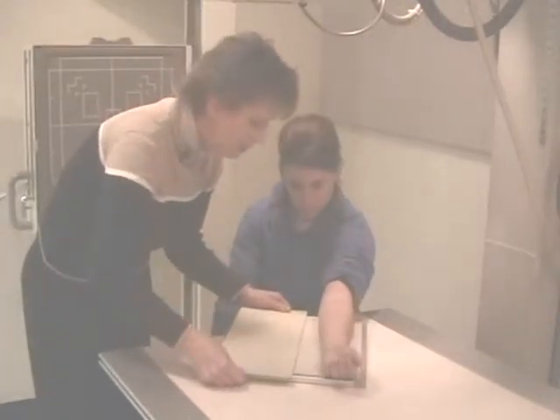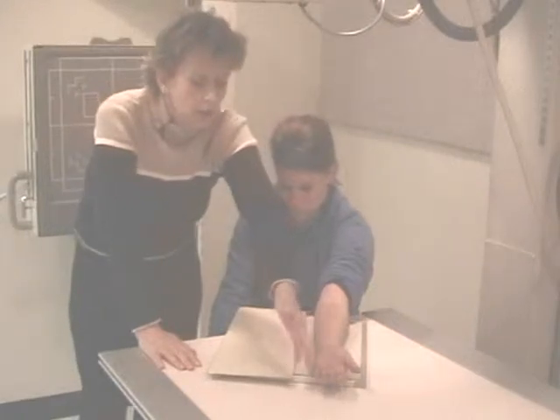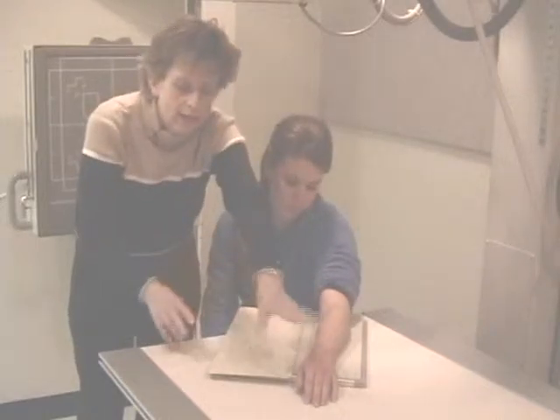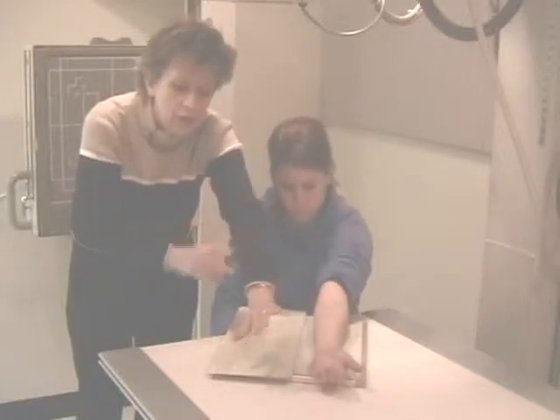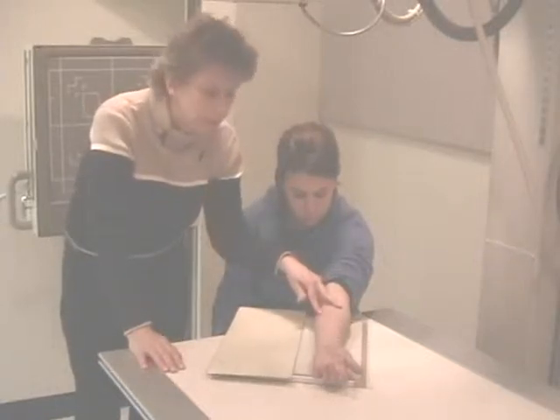Why am I doing APs? If you recall from your reading, as you roll the forearm, the radius and the ulna, they'll actually cross over. In a PA position, the bones have crossed over one another. So we don't take a PA projection, we do an AP. That way the radius and the ulna will stay free from each other.